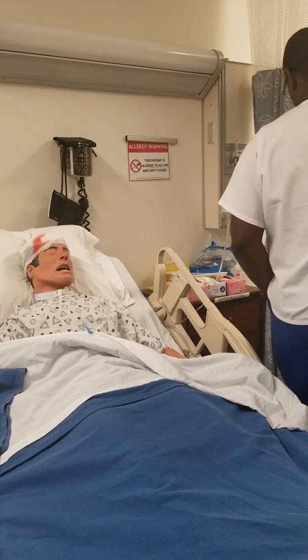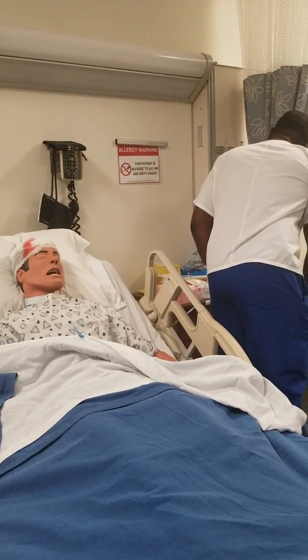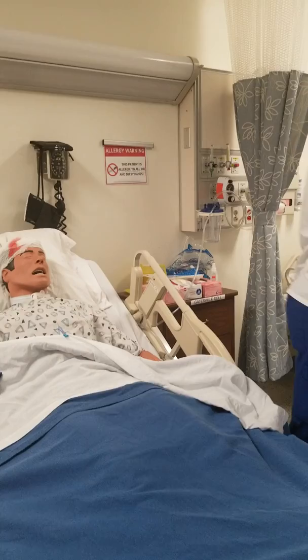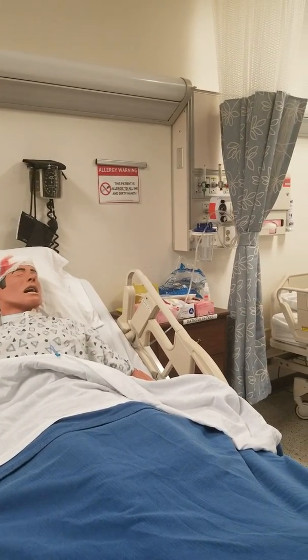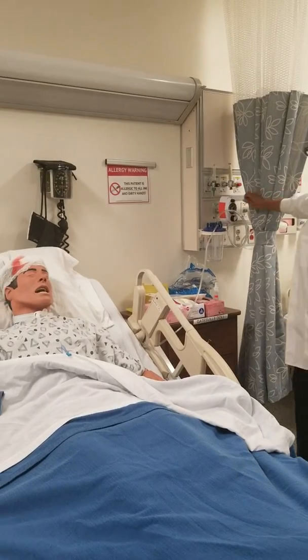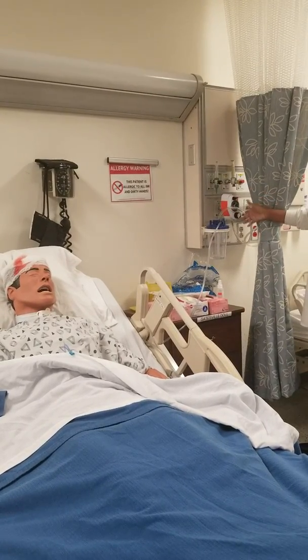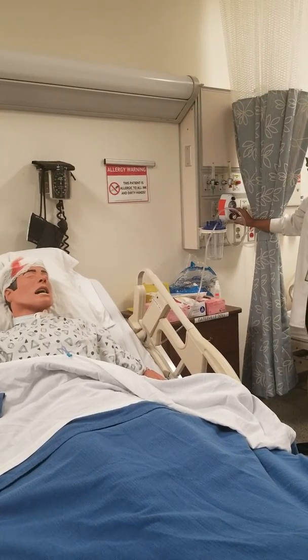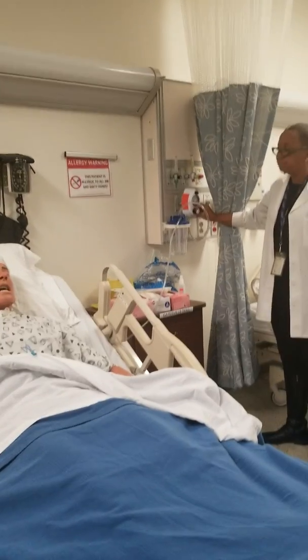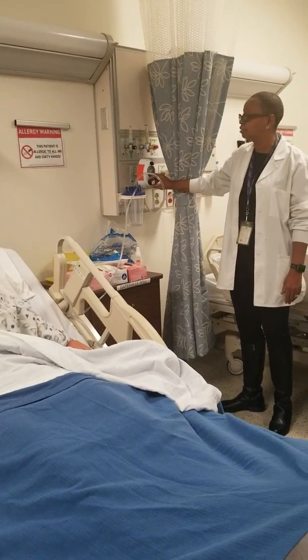It says off, continuous, and intermittent. So I have a choice on where I want to set his suction. When I'm suctioning him, yes, I'm going to turn it to continuous. By the time I hear the suction come on, what else do I need to do? I can dial his flow rate. This is how you dial his flow rate.